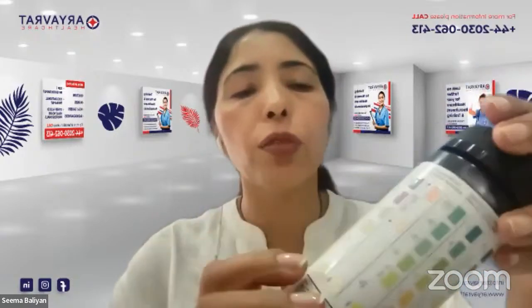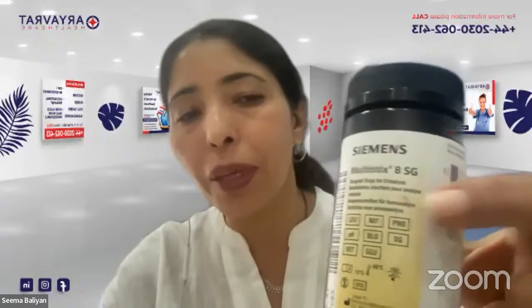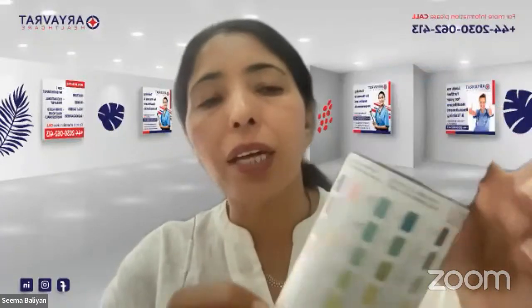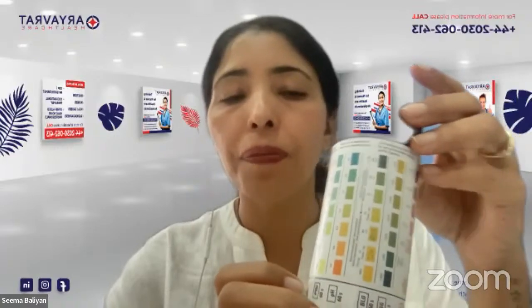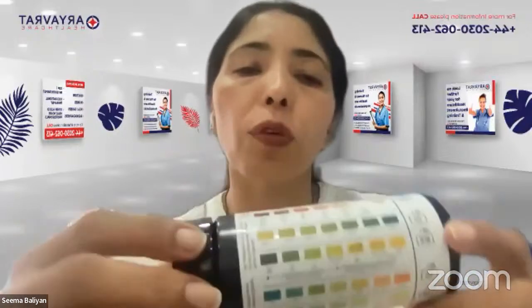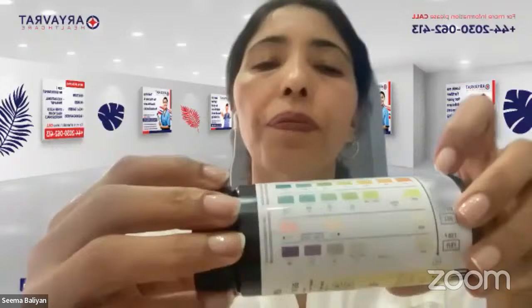If you check this bottle, the name is upside down, but you can see that it says 8SG or 8X. That means that it is going to check 8 parameters, or 8 things that it can check. And all of these 8 are going to be marked on the side. So when you are checking, you will check against the color.